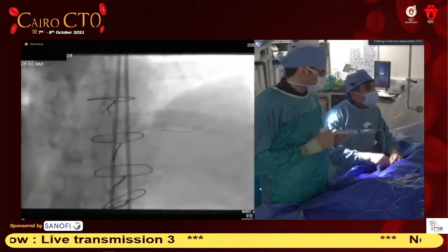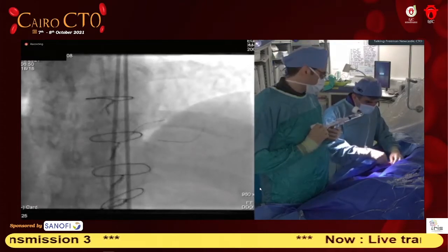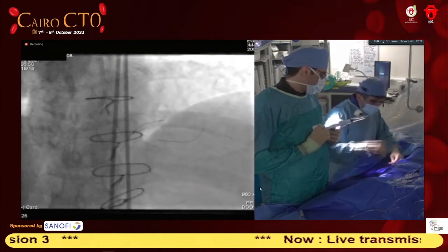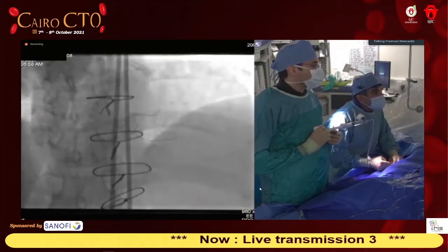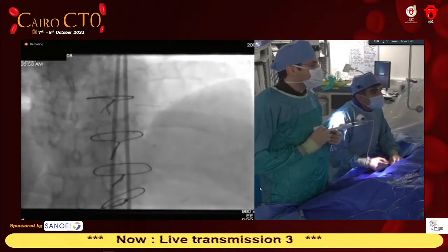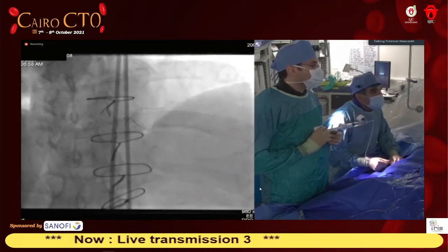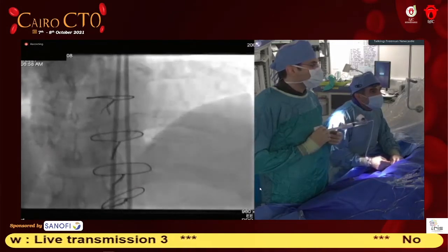There is a question now. Yes, I can, and I think I'm okay. I'm in the right place. But what I will do is I'll re-engage my vein graft guide, and give you a retrograde approach just so everybody's happy that we are where we are. But that's absolutely important because you don't want to be deceptively thinking you've gone where you went and you're wrong. You're in the wrong artery. You end up with perforation and with problems.